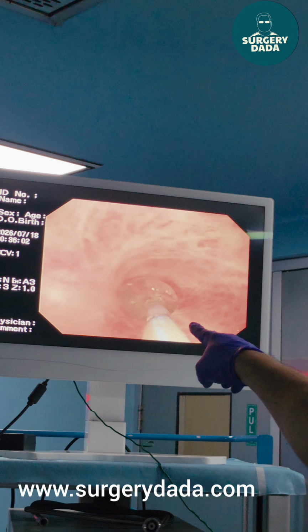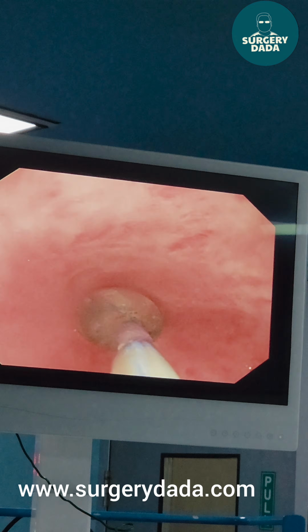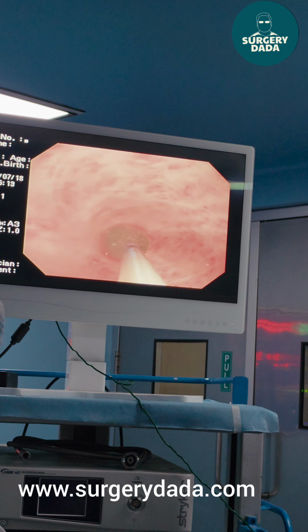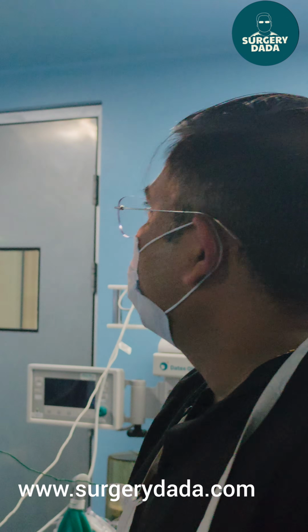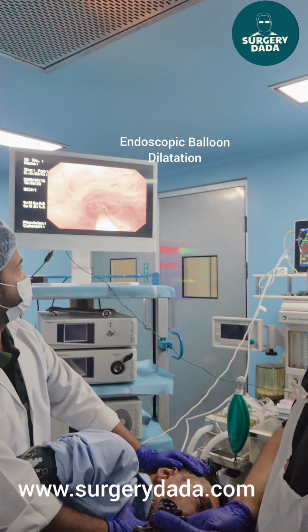You can see this is the balloon. It is getting filled with saline. So this is what is a classical endoscopic balloon dilatation for the strictures. Okay. Deflate it.